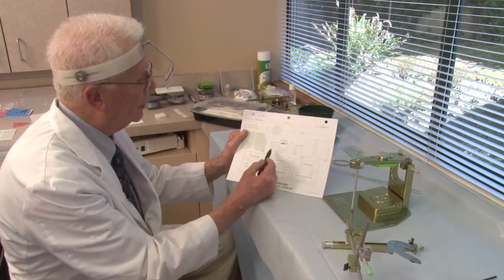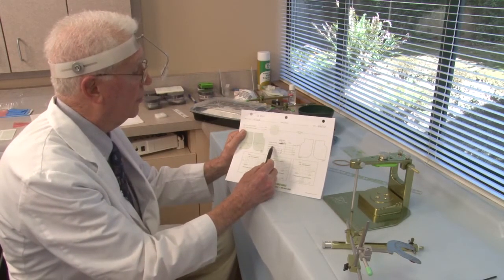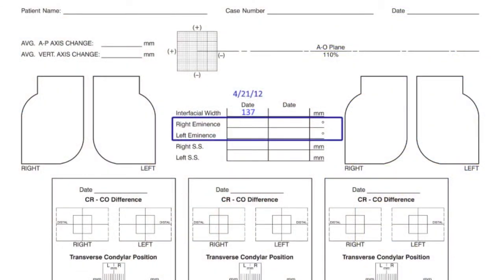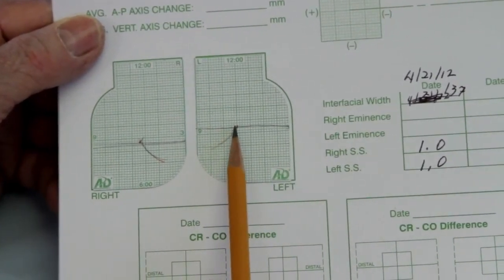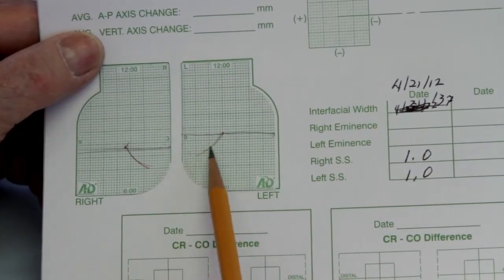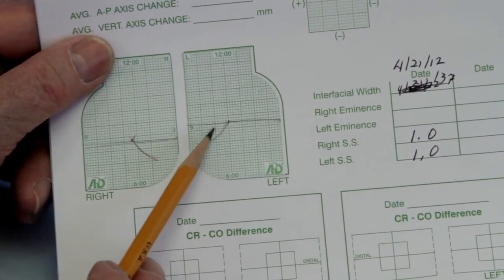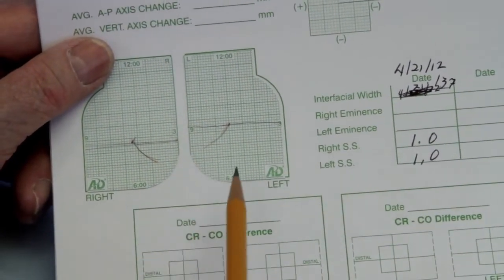Okay, now I've recorded the immediate side shift, right and left sides, on 421/12. Now it's asking for the angle of the eminence, right and left sides. So we have to measure now the angle of the eminence. Now this line is the axis orbital plane. Here was the hinge axis mark, centric relation, and the patient's recording. Notice how all of the recording lines, all movements, basically superimpose. This tells us that the patient was well stabilized and that there's no muscle dysfunction or anything. So it's a very good, clean recording.